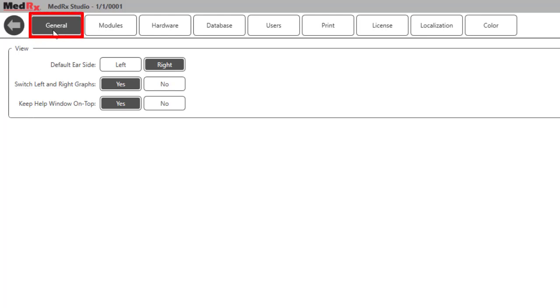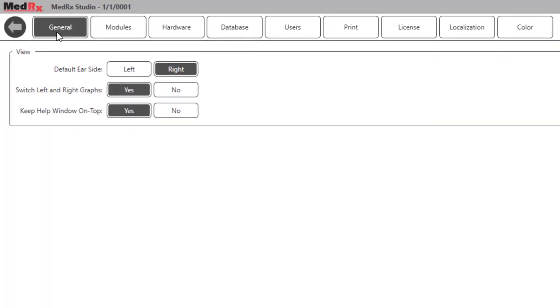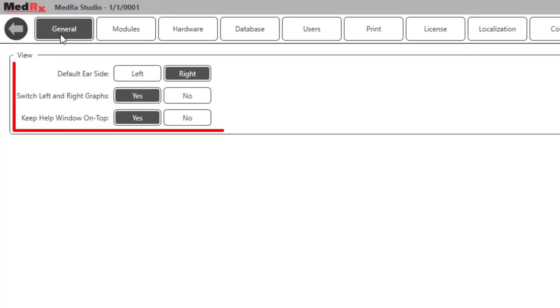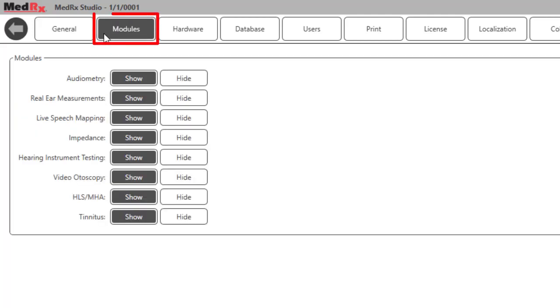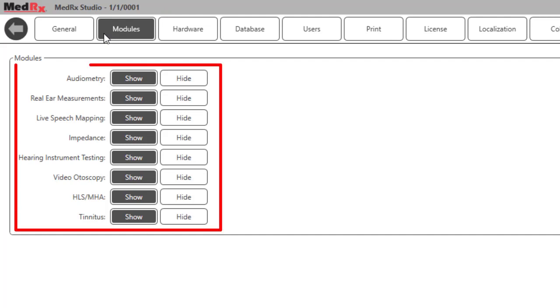The General tab sets the default ear, left and right graphs, and the setup of the help window. The Modules tab will allow you to set up which Medrec modules you would like displayed on your startup screen. You can display single or multiple modules depending on which hardware you have.